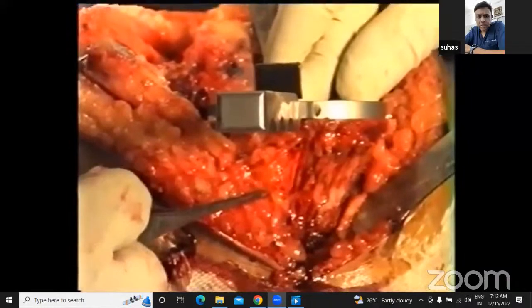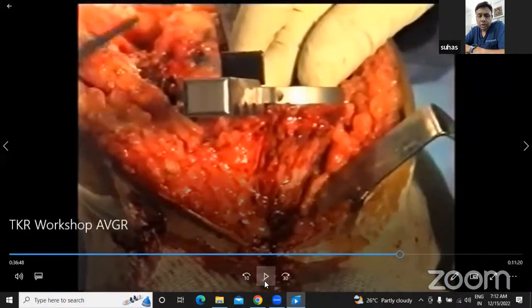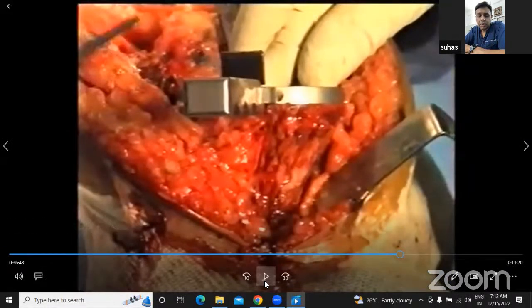There was some mix-up in the nomenclature there. If you are externally rotated beyond the Akagi line, which is the medial border, you're externally rotated. If you're inside, if you're turned in, then you're internally rotated. So there the idea is to stay externally rotated. If your tibia is internally rotated, you'll have an issue with tracking, with range of motion and things like that. But that's the first point.